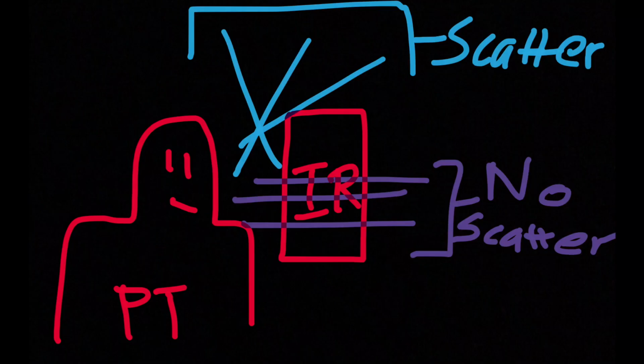So if I have this air gap technique, I'm allowing it to not hit the image receptor right away. I'm allowing it to possibly skip and miss the image receptor, adding to scatter in the room, right? So that's something we have to keep in mind and why we need to be far away. But it's going to reduce our scatter to the image receptor, but scatter adds IR exposure.